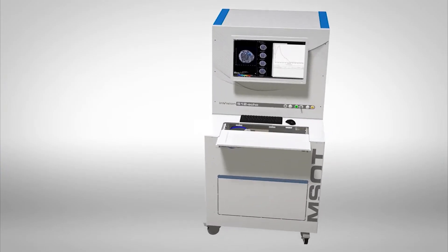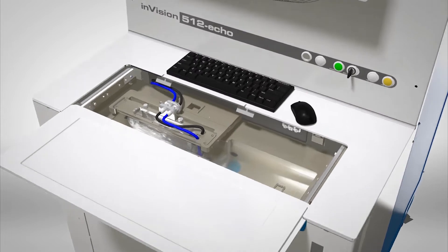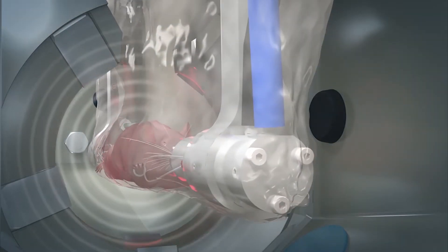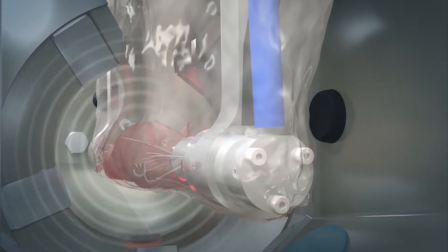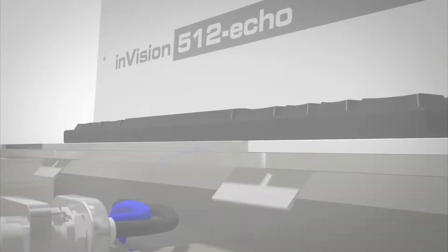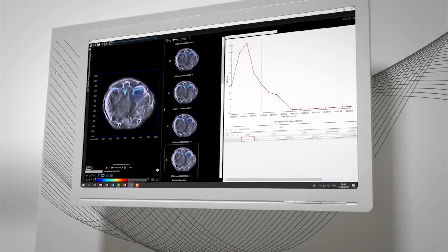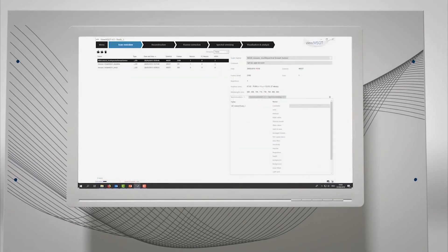Ithera Medical offers opto-acoustic imaging systems. The MSOT InVision is designed for small animal imaging. This video describes the functionality of the integrated VIEW MSOT software for data post-processing.